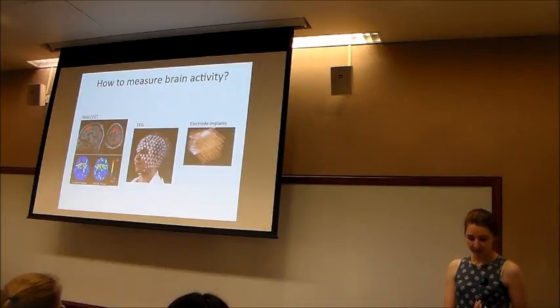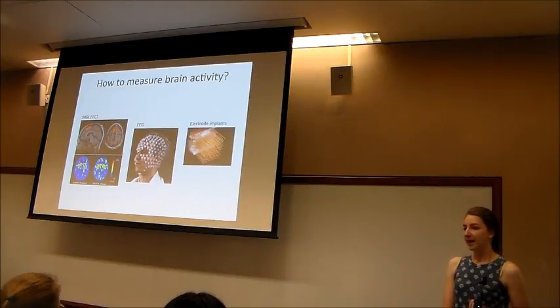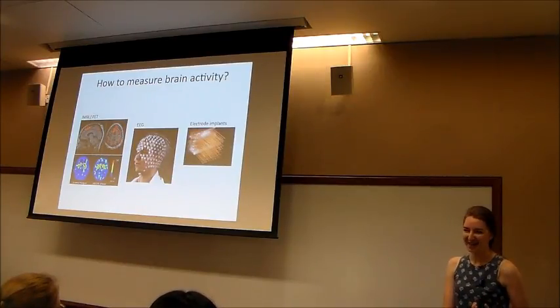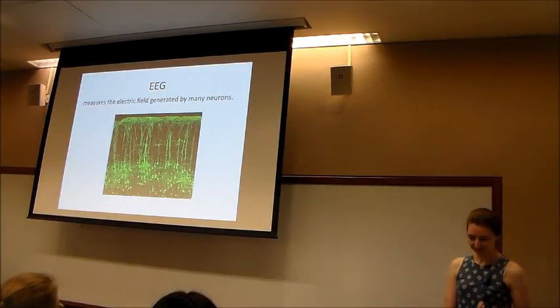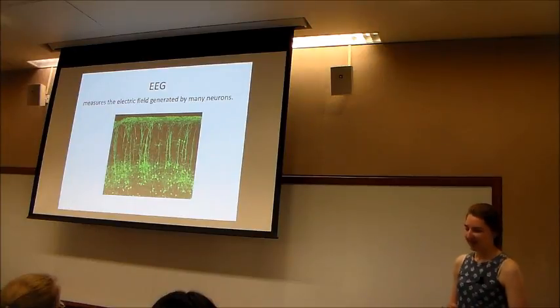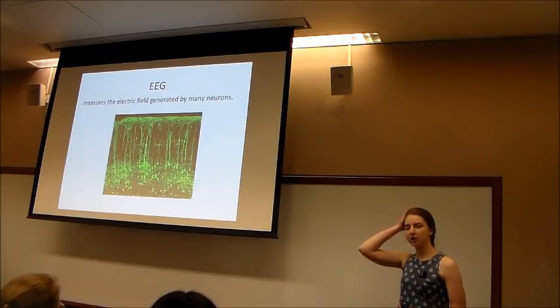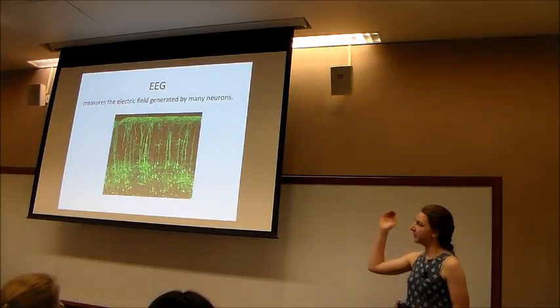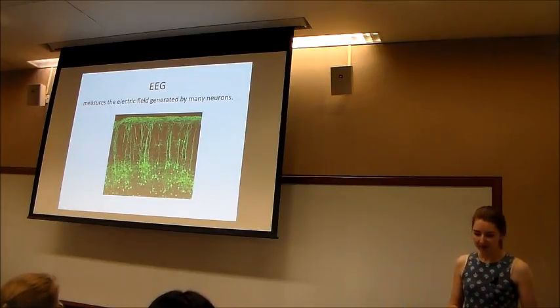So yeah. So if you guys had a choice of which way you want to look at your brain activity in class today, which one do you want to do? EEG. I hear you guys pretty unanimously saying EEG, and you're in luck because that's what we're going to do. So when you're doing EEGs, as I mentioned, you have these electrodes on your skull, so that electrode will pick up activity from the whole chunk of brain that's below that spot. So that means that you have many thousands of neurons that this one electrode is listening to. And that makes things a little bit complicated.